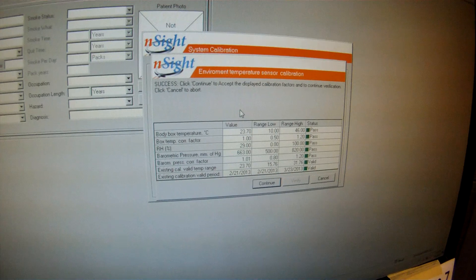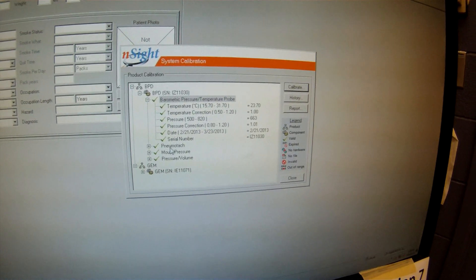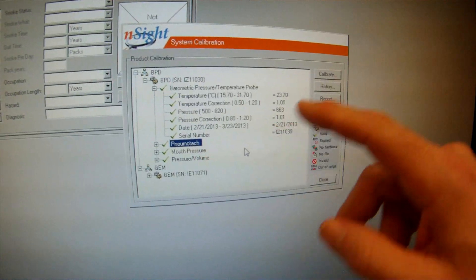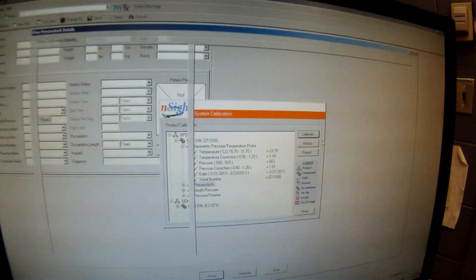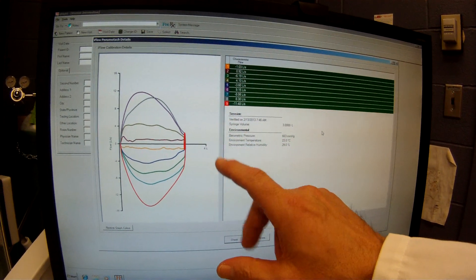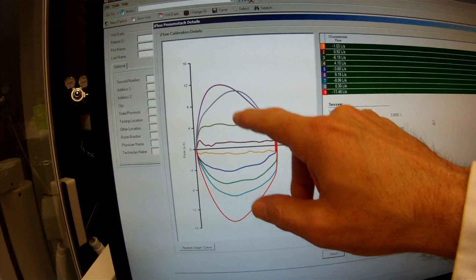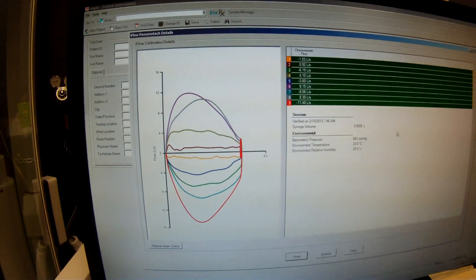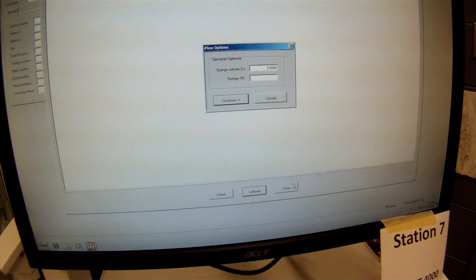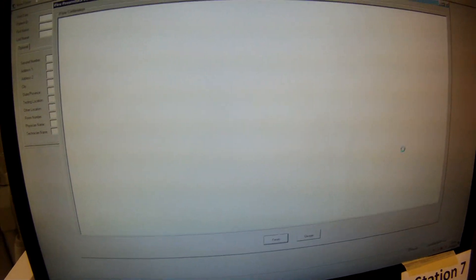It says success — we're ready to go, so we continue on now. We're going to actually calibrate our pneumotach. So we'll go up here and hit calibrate. Now, it shows us one of the older calibrations that's been done, and from this you can see that it's very important to do low, medium, and high flow rate calibrations. Click on calibrate. We're going to use our 3-liter syringe and continue on from that.